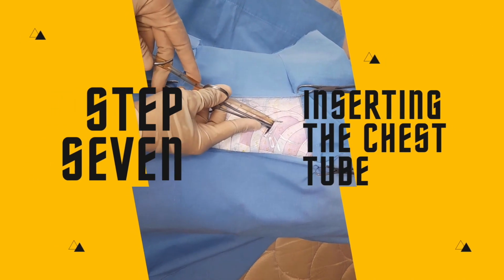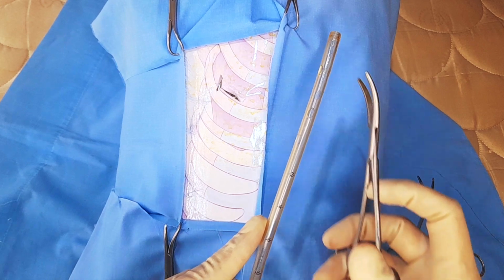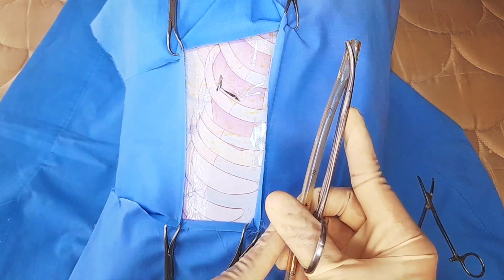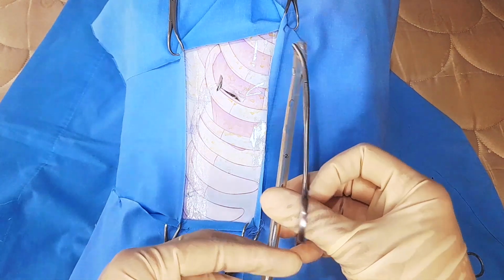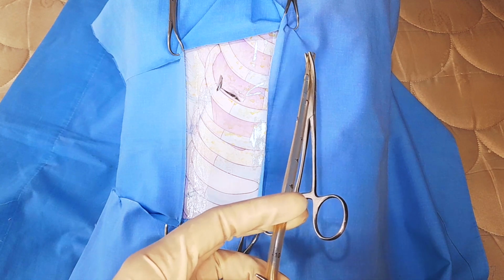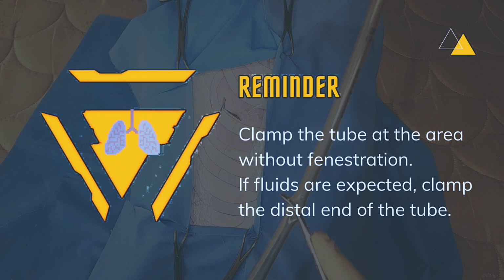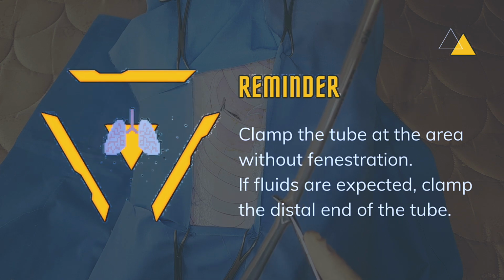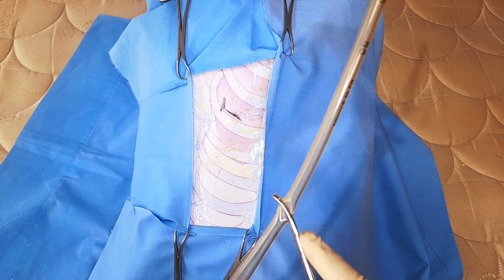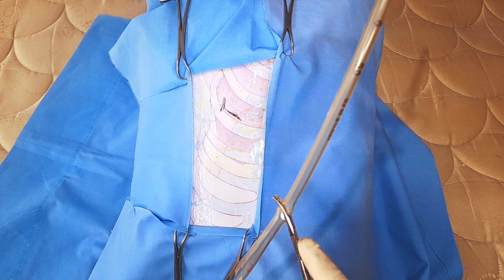Step 7. Inserting the chest tube. Clamp the chest tube at the tip of the fenestrated end with a Kelly forceps so that the chest tube and Kelly forceps are parallel to each other. Clamp the tube with another Kelly forceps at the area without fenestration. If you expect fluids inside the pleural cavity, also clamp the distal end of the tube.